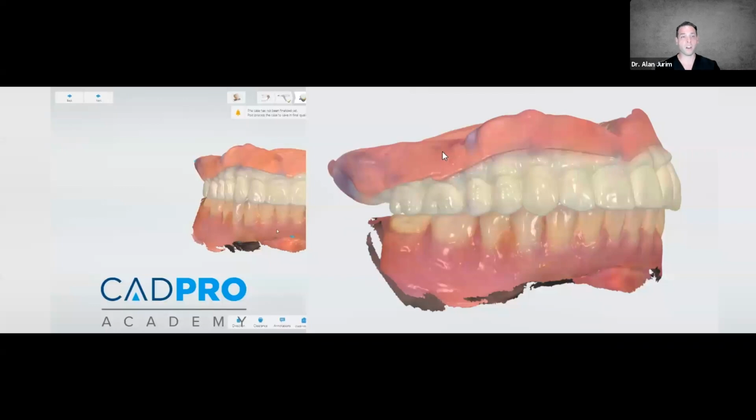If we decided that I wanted to do it completely digital, I have all the digital information. I can go ahead, design the denture, and then print it. If we wanted to use this for implant planning, for an edentulous workflow, we can also use the data at that time to help mount the case and to help set it up.